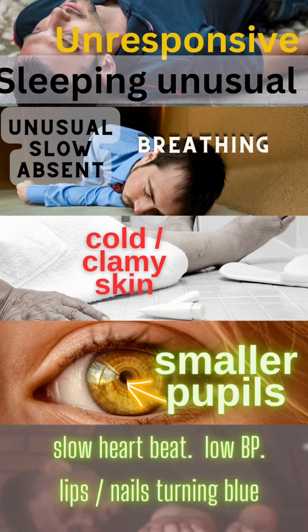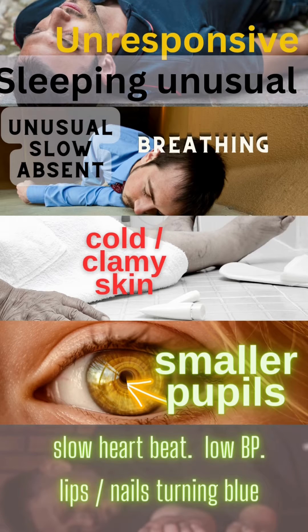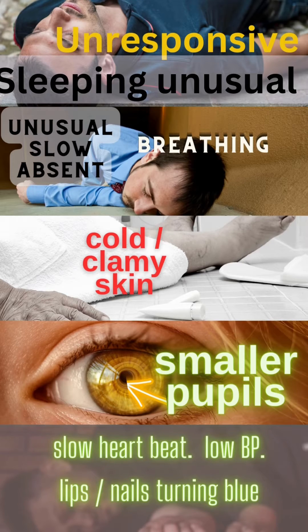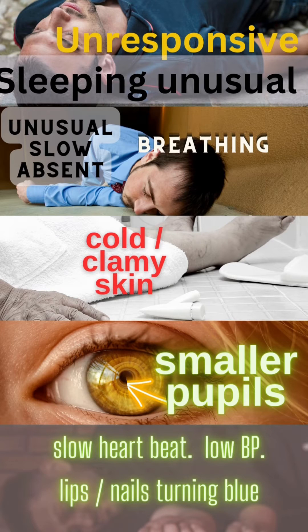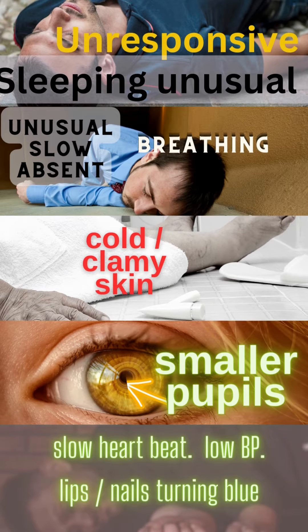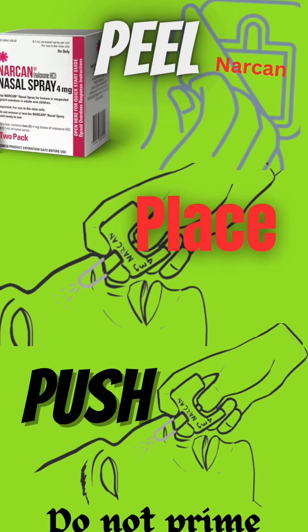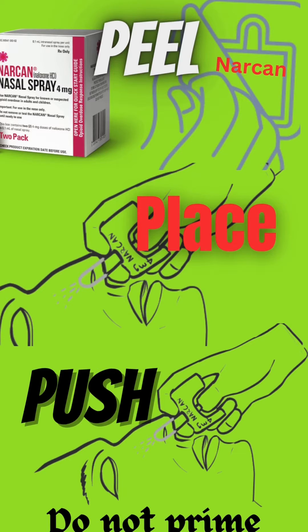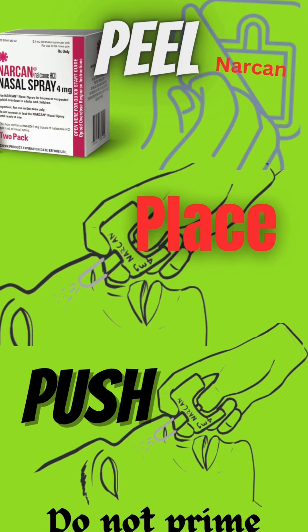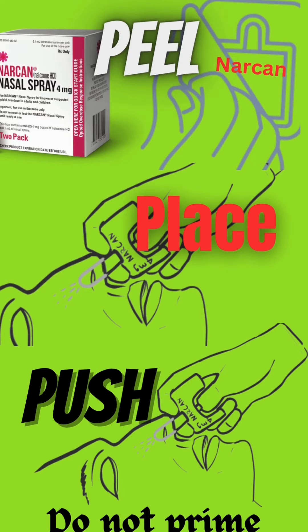Signs that a patient needs Naloxone include: unresponsiveness, unusual sleeping, unusually slow or absent breathing, cold clammy skin, smaller pupils, slow heartbeat, low blood pressure, and lips and nails turning blue. Open the box, peel the back, place it in one nostril and push it without priming.